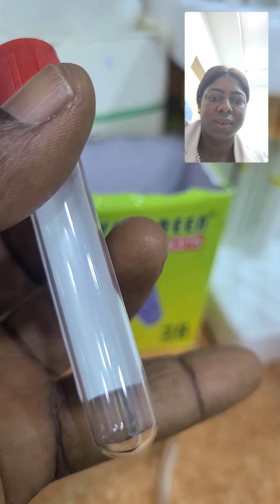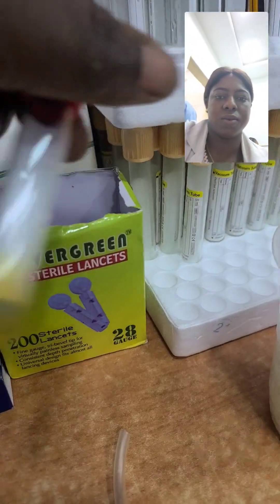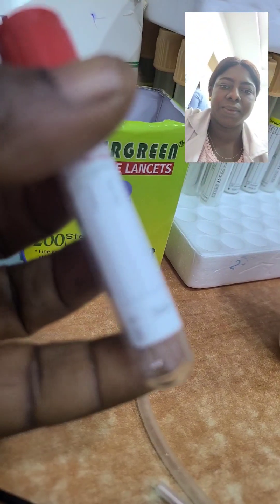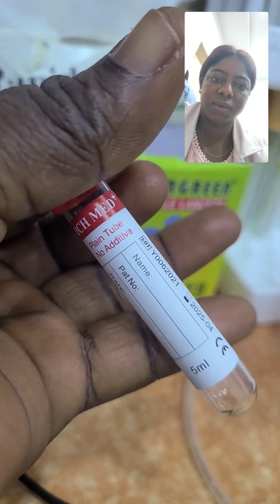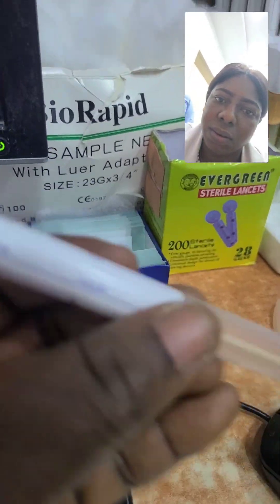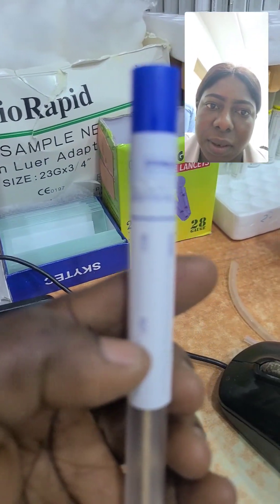This is a plain bottle — the red cover is a plain bottle. Most of the time, after we use the gold cup (the yellow chemistry tube) to collect a sample and spin it, we transfer the serum into the plain bottle. As you can see, this is serum.